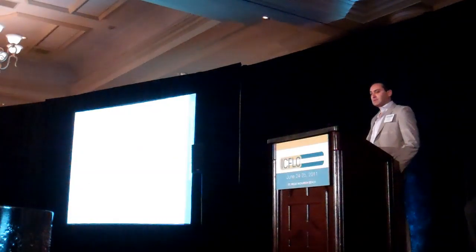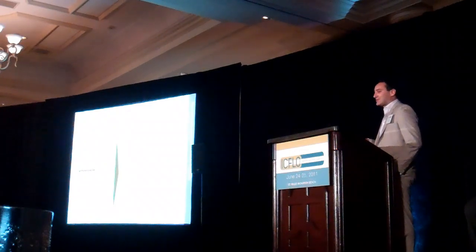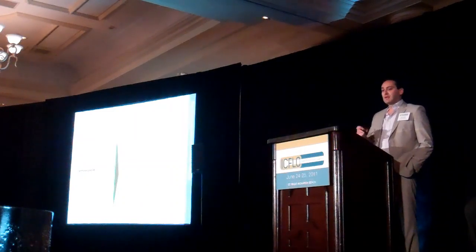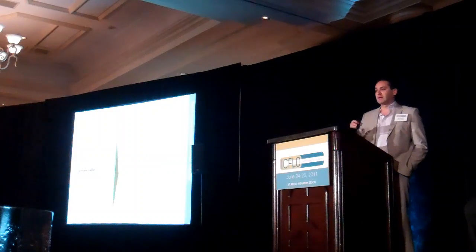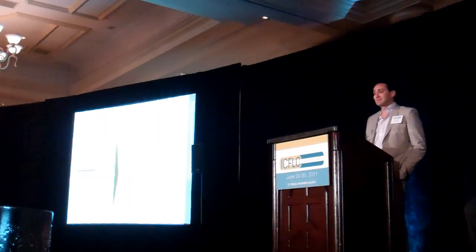But what about the other issues? How does the femtosecond laser change our current profile? I would argue that these things can be addressed just by software treatment planning. By putting all the parameters into a computer, it can measure the corneal thickness, and we decrease our risk of perforation, operating on the wrong axis, or having incisions not perfectly aligned on axis. But that leaves us with these topics. How does the laser affect each of these different things?